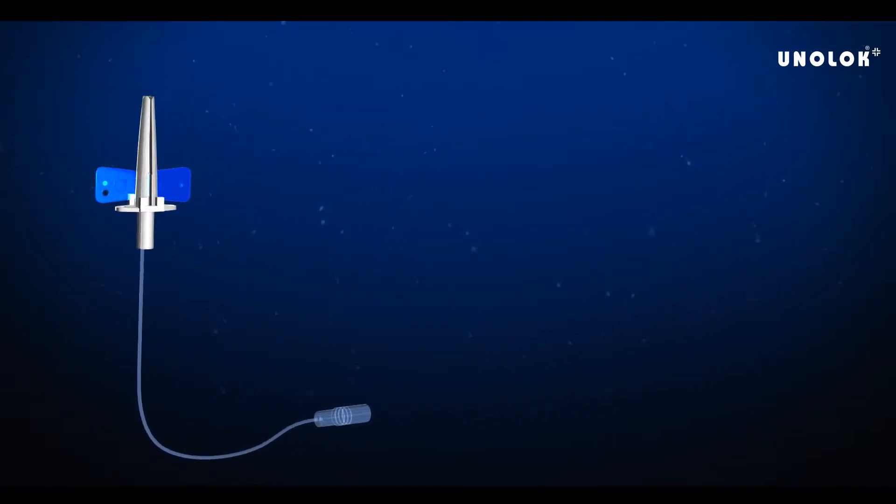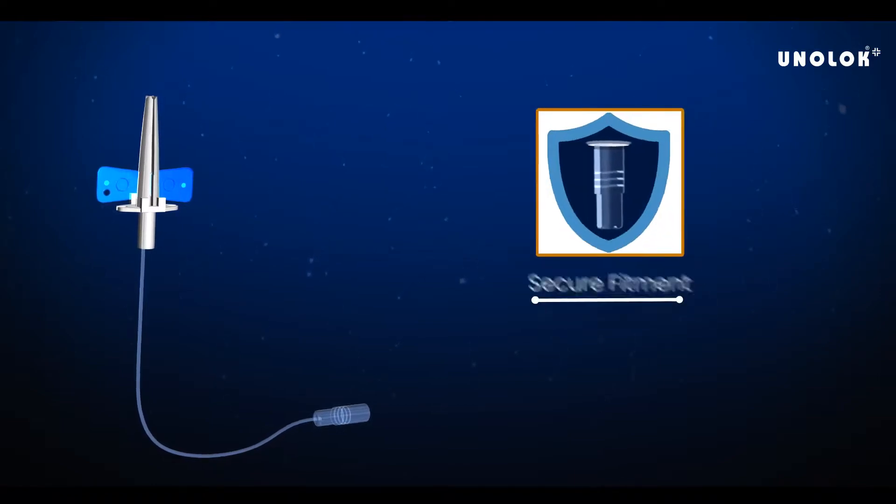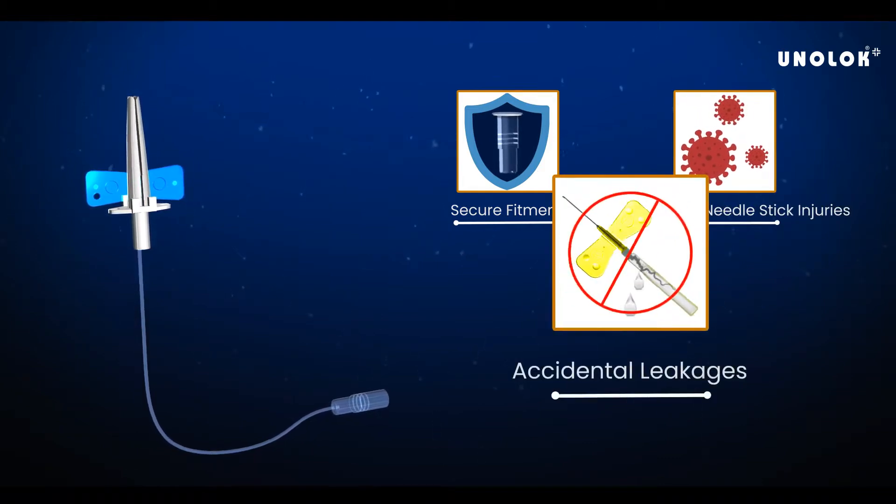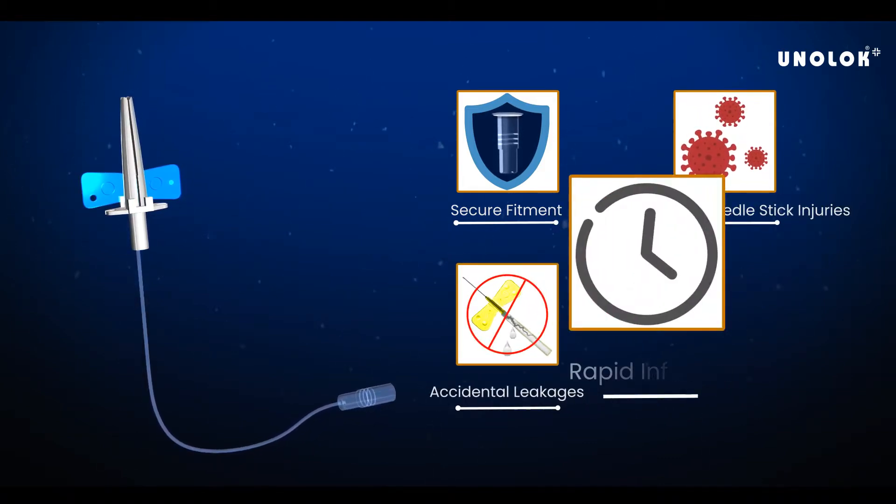Uniloc Plus Infusion Set provides secure fitment, prevents reuse and needle stick injuries, prevents accidental leakages, and is ideal for rapid infusion.